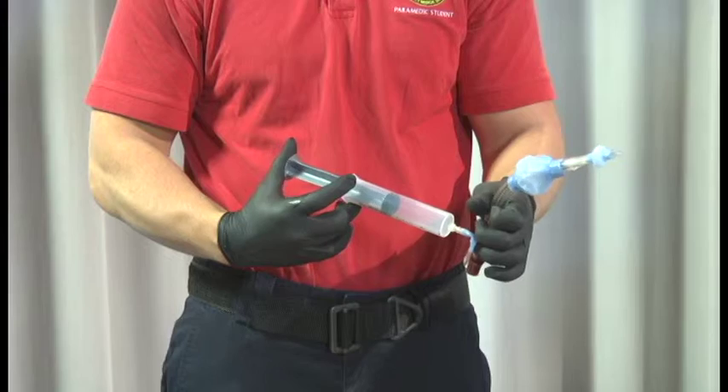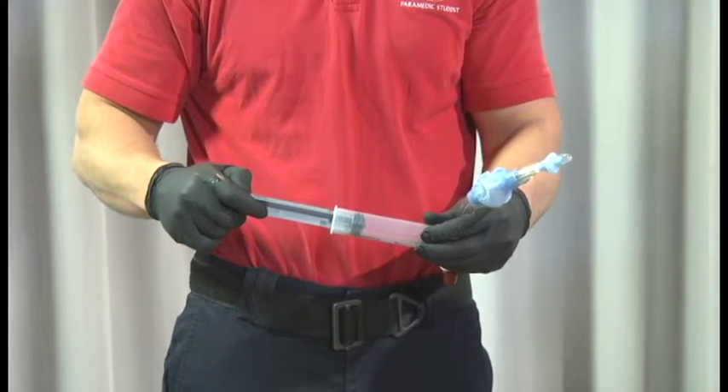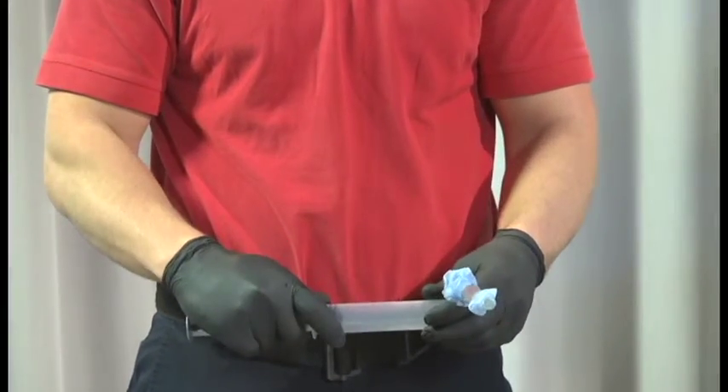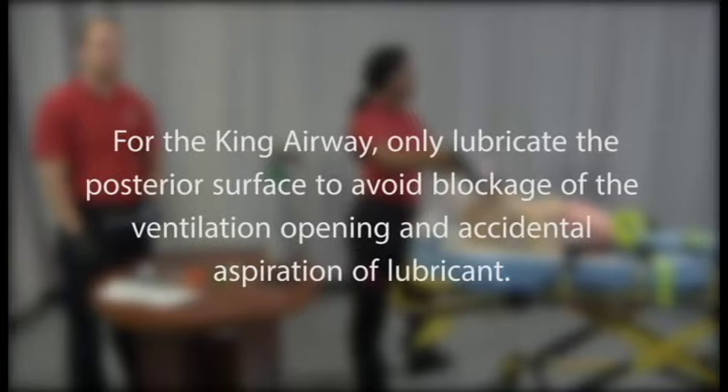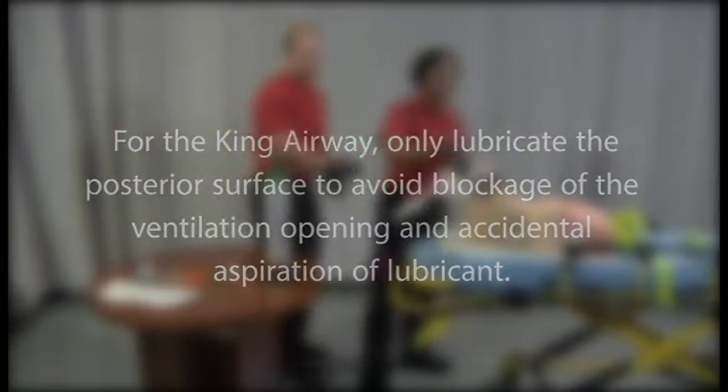Test cuff inflation and be sure to remove all air prior to insertion. Lubricate the distal tip of the device. For the King airway, only lubricate the posterior surface to avoid blockage of the ventilation opening and accidental aspiration of lubricant.